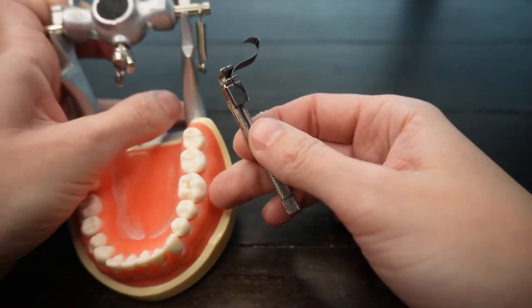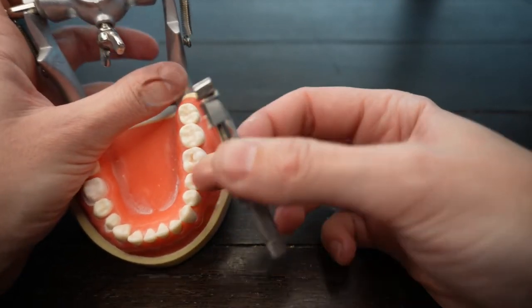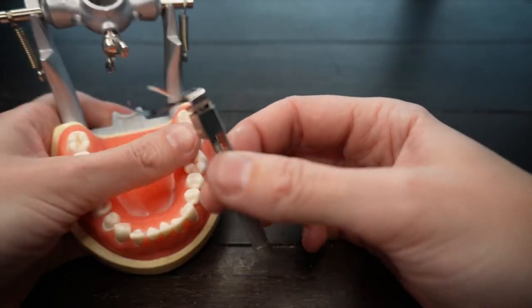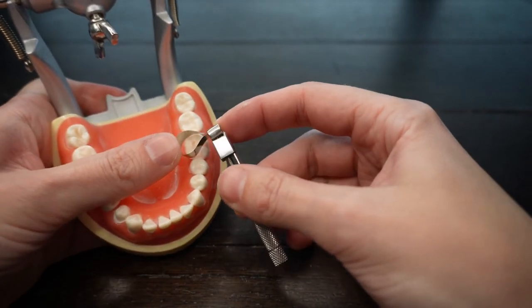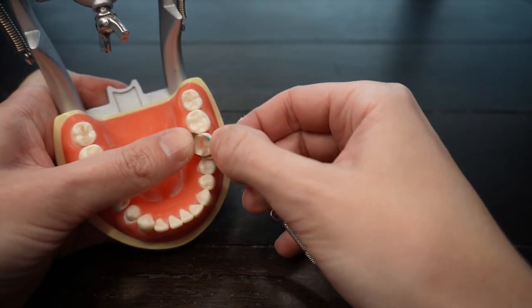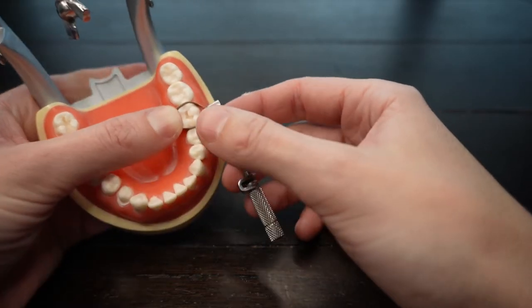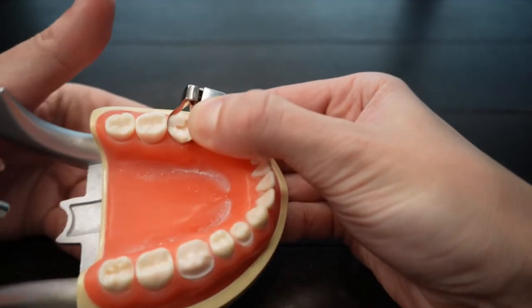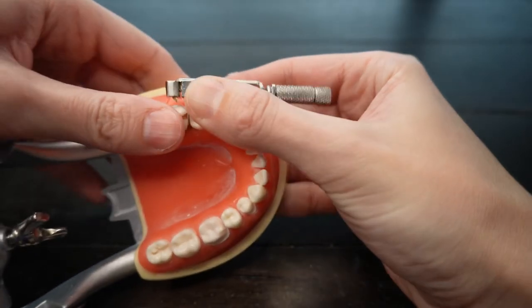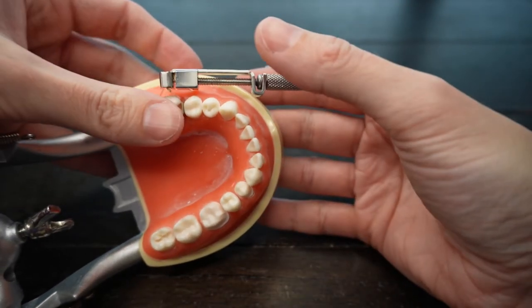Now the important moment. Before you proceed, you need to flip the Tofflemire down. That way, the smaller aperture, remember this one was smaller, will go down and it will follow the shape of the tooth. Once this is on, so you place it all the way on the tooth, you gotta hold down your matrix band. See, that's what I have so far.